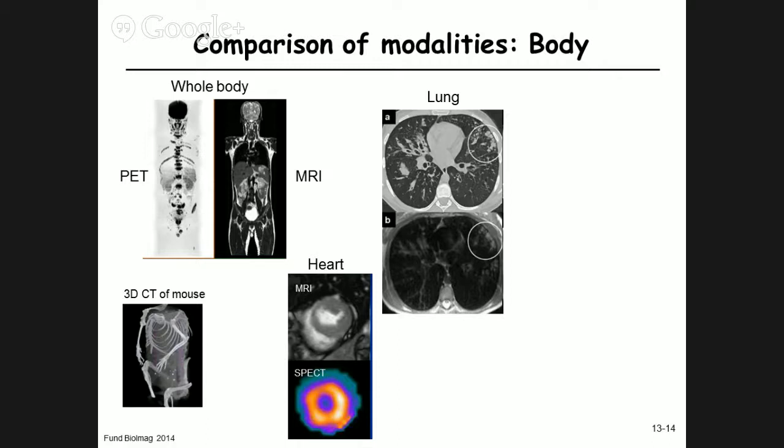Okay, you look for structures that correspond to bone. What do you see? The vertebra, and you see the rib cage here. So this is a CT scan. You don't see this as well. This is the corresponding MRI of the lung here. And this is obviously some lesion inside the lung that shows up.